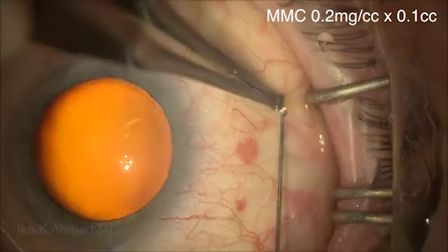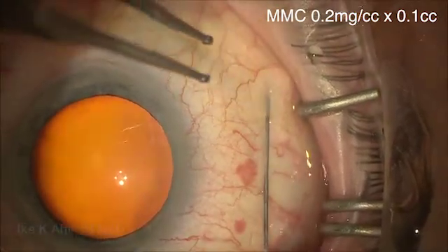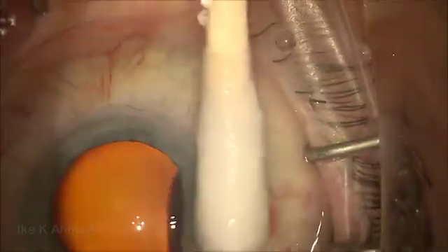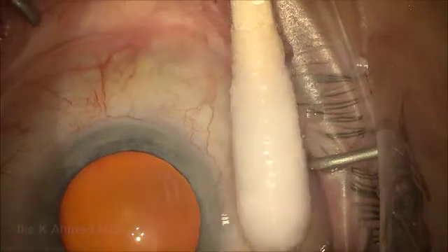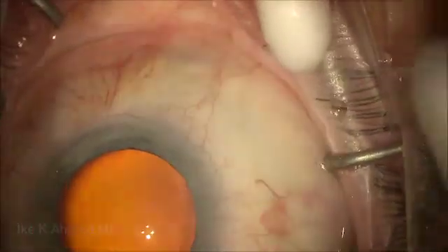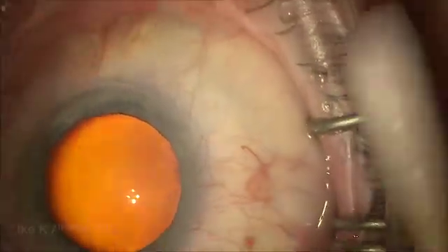We'll start with the mitomycin injection on a 30-gauge needle here, being placed 6 to 8 millimeters back from the limbus, injecting an intratenon dose of mitomycin — a small dose of 0.1 cc at 0.2 milligrams per cc concentration — and having the patient look down while rotating a moistened Q-tip to keep that mitomycin back away from the limbus.